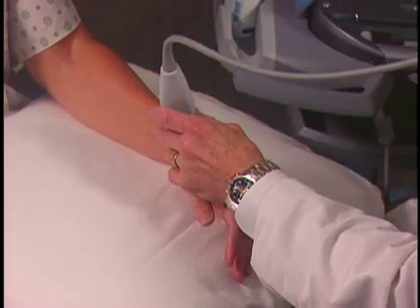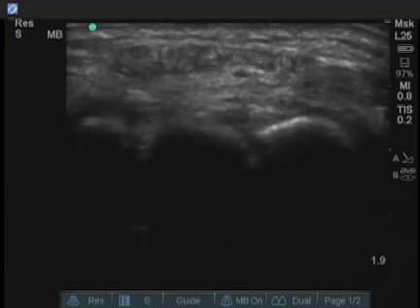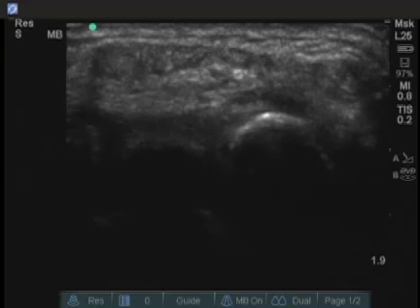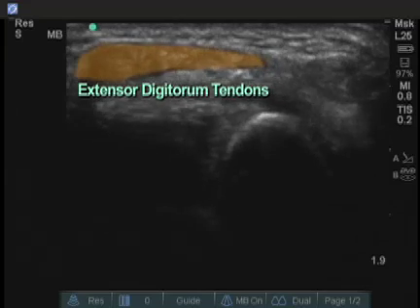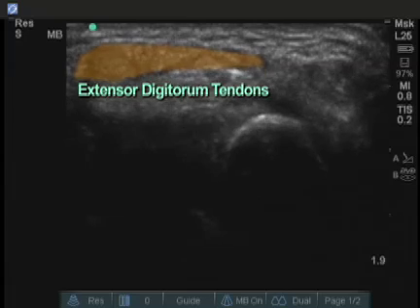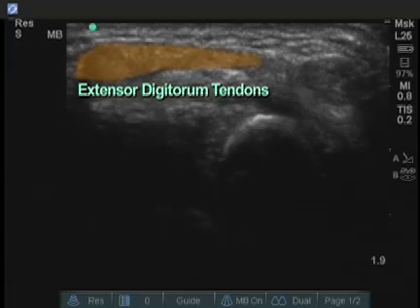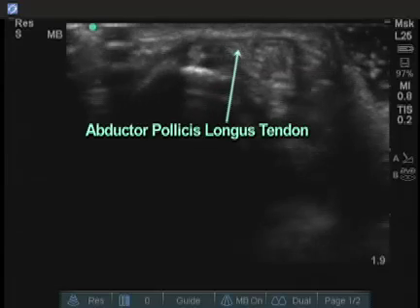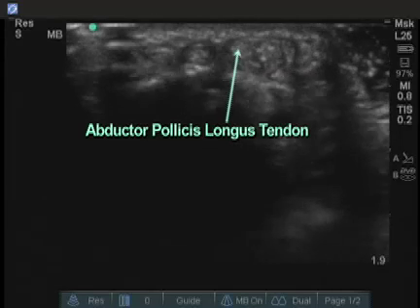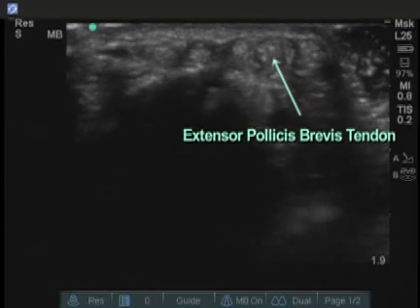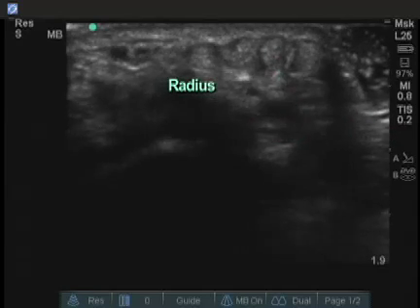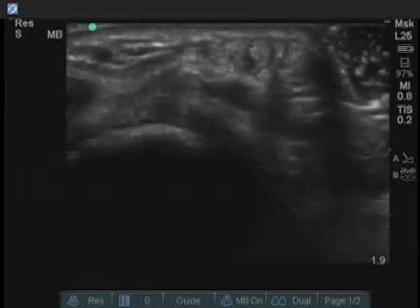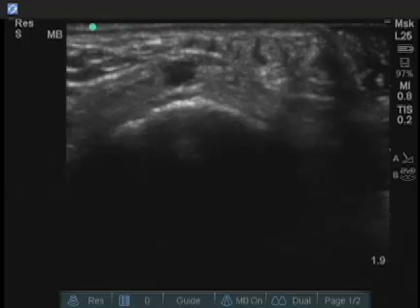We'll move over to the extensor tendons of the thumb, where you can sometimes see DeQuervain's tenosynovitis. Here is a nice view of one of the long tendons of the thumb. These extensor digitorum tendons are normal in appearance on cross-section. These are the two thumb tendons that you see right over the distal end of the radius, which is right here.